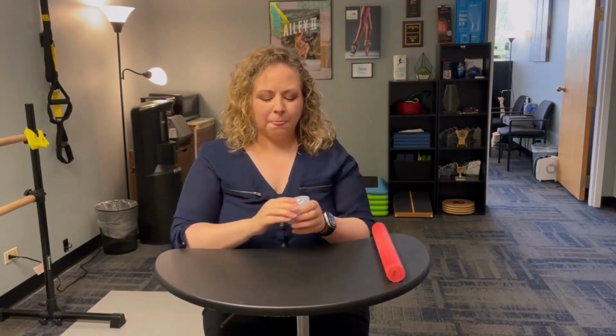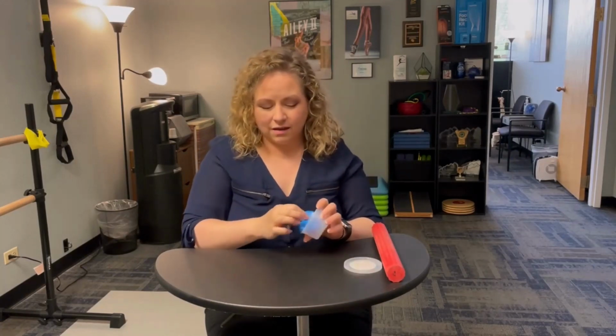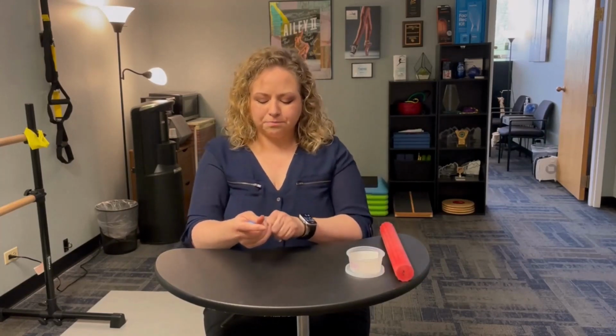To really work on the hand more specifically though, we're going to use resistance putty. They come in different strengths. It's essentially like silly putty. You want to make sure, if you have a latex allergy or anything like that with some of these different things, they may contain latex. So double check that before you purchase it.